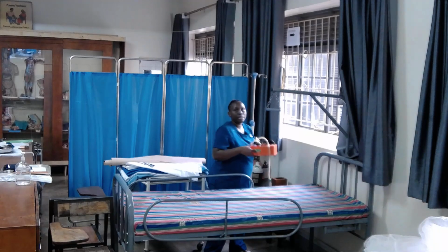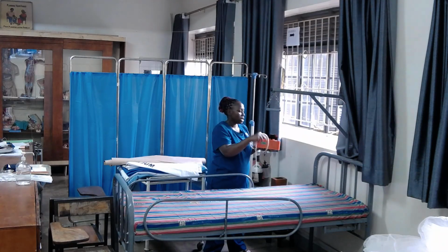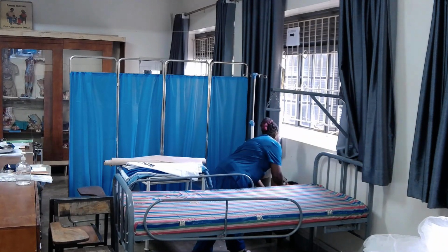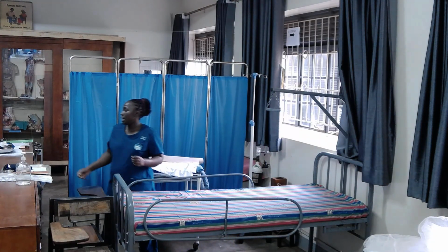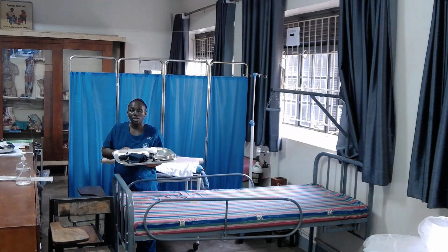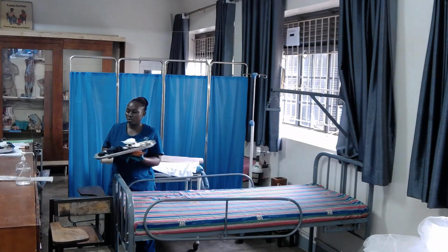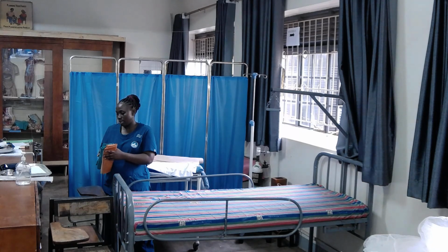Still at the side, we need a suction machine. These patients usually get problems with their breathing. Secretions go and block the airway, so we need a suction to suck out those secretions. So still about the requirements on the side, we need an observation tray because they need constant observation. So we have an observation tray to take their vitals, the BP, the temperature, the pulse, and the respirations.